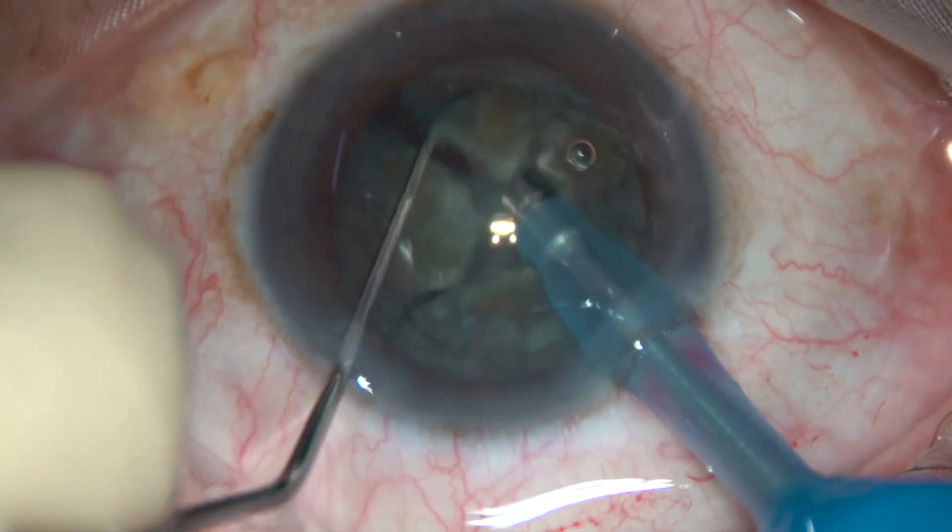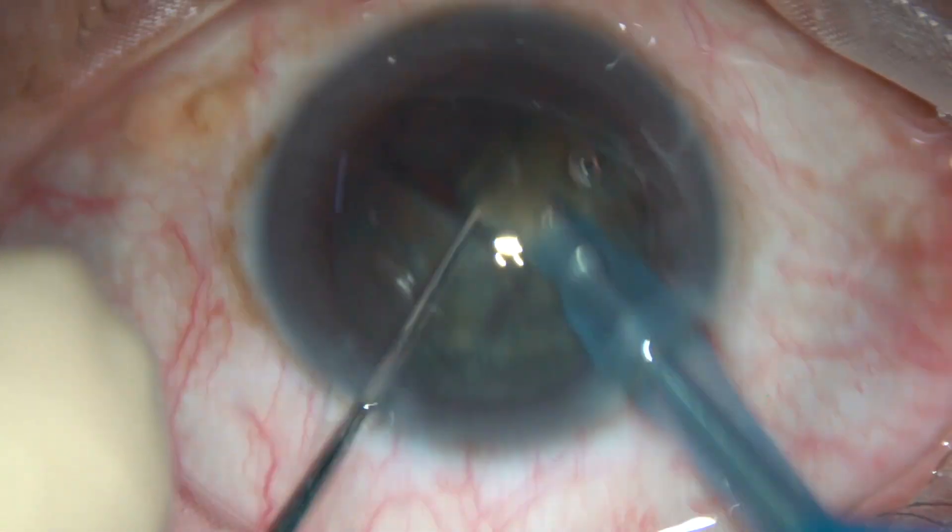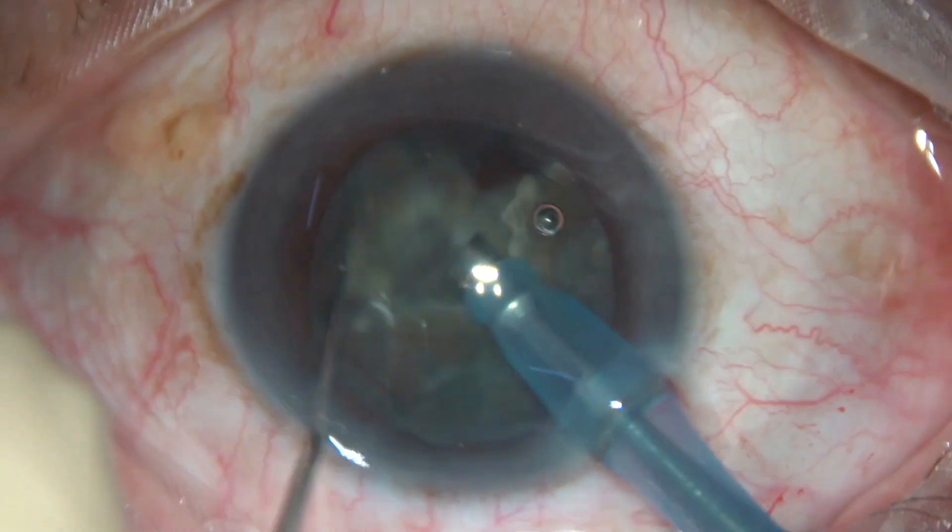So the nucleus is divided into four parts. Now each fragment is emulsified and removed.